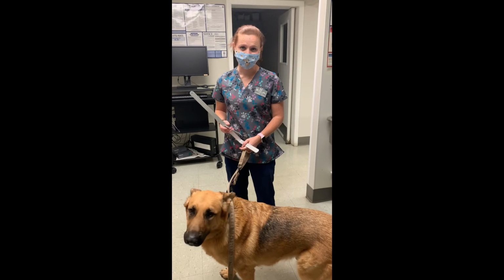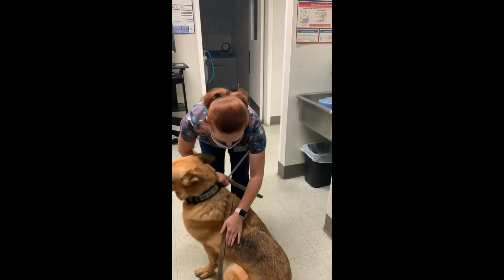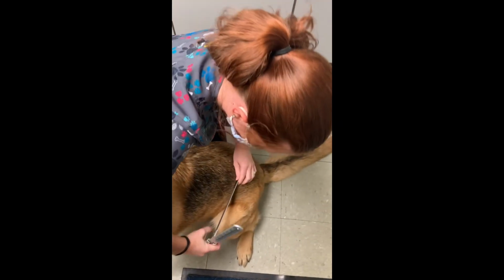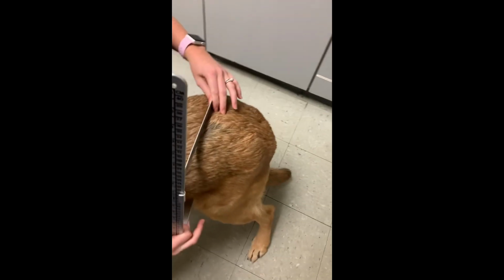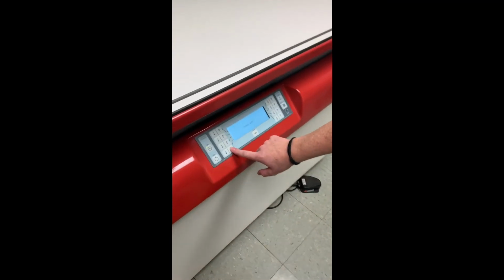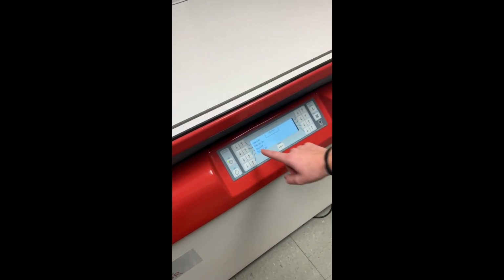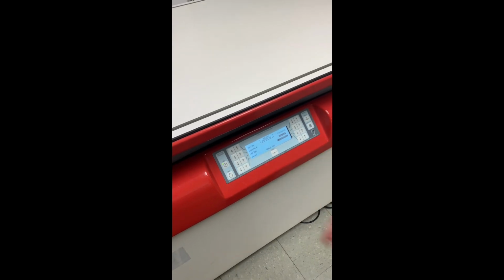So to measure for the VD pelvis, you will want to measure at the widest point of the hips. And since we're going VD, so ventral to dorsal, then we will measure the thickest part here. So we're right at 17 centimeters. So then we'll go over to our x-ray machine. Press the AP. Since we're doing pelvis, we'll click that button. We're doing VD. It's already at 16, so we'll move it up to 17, and we are ready to take our x-rays.